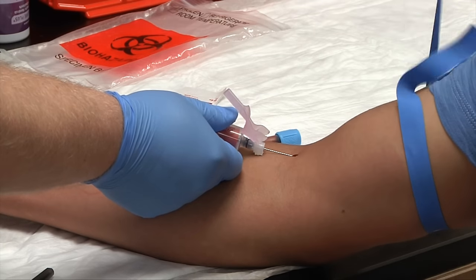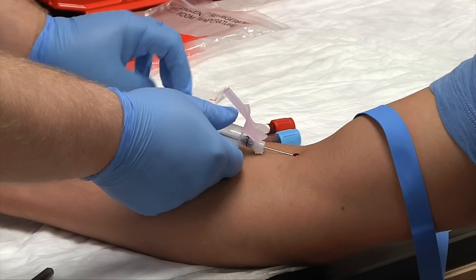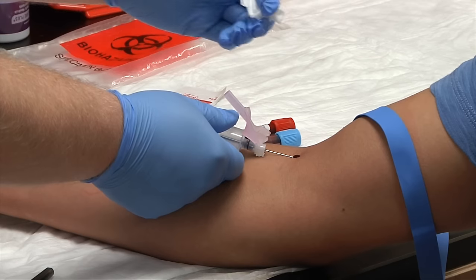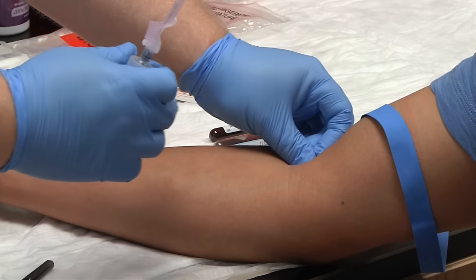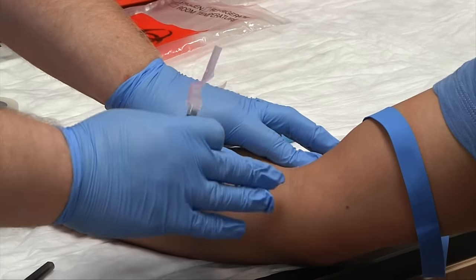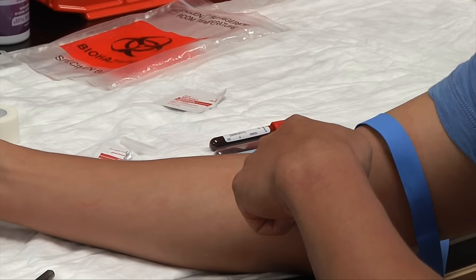This tube is full and it's my last tube, so I'll release my tourniquet and pull the tube out. Get your gauze folded over once, twice, pull your needle out, cover, and immediately safety cap. Ask your patient to hold the gauze: 'Sir, will you please hold that.' Immediately take your needle to the biohazard container — you do not set it down on the table. We must protect ourselves first. Then grab the tape you've already torn and place it over. Instruct your patient not to bend their arm, as this can cause a hematoma.